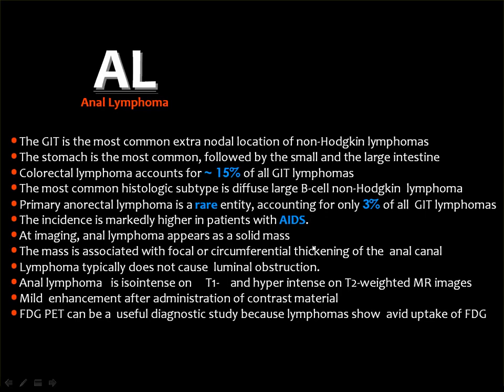Then lymphoma will appear as a solid mass. It will show mostly a homogeneous signal and homogeneous density with somewhat contrast enhancement.